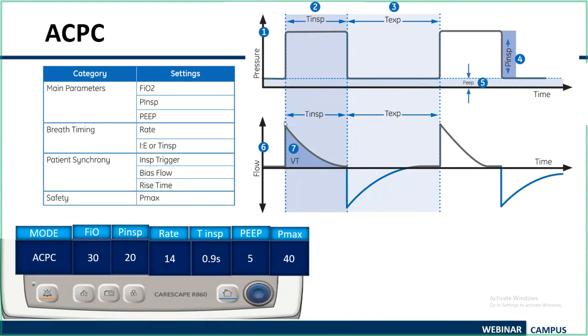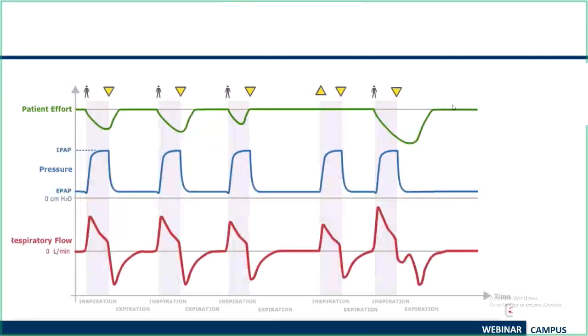And again we have inspiratory time and expiratory time. You divide between inspiration and expiration depending on the IE ratio. So now in assist control, what happens? I've already told, the patient can trigger, then the machine will give a pressure control breath. The machine will cycle. The yellow is for the machine. The next patient is triggering, but after that the patient goes into an apnea.